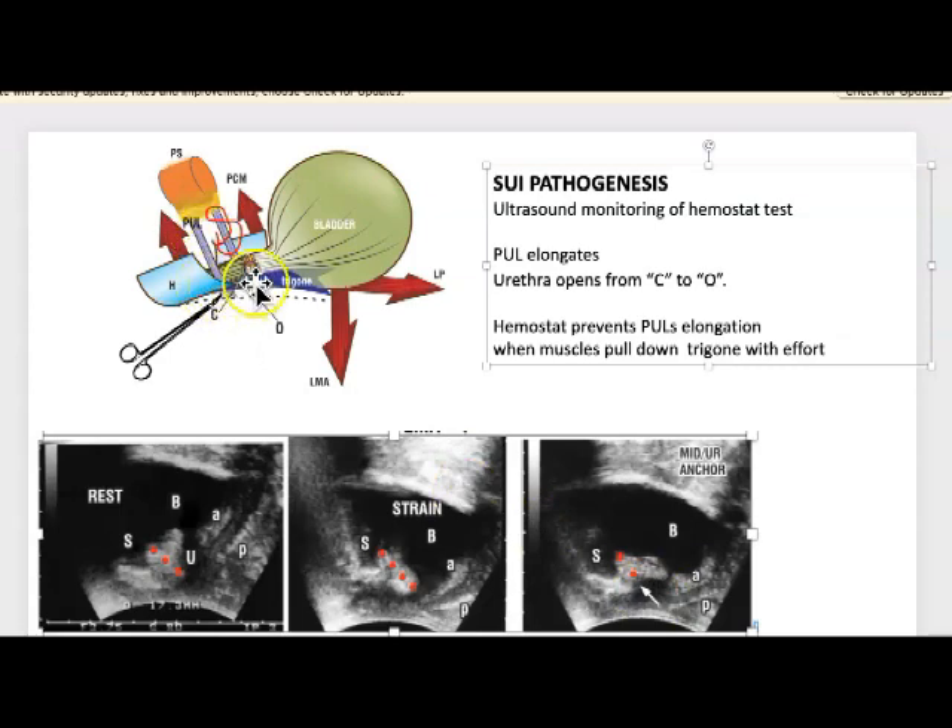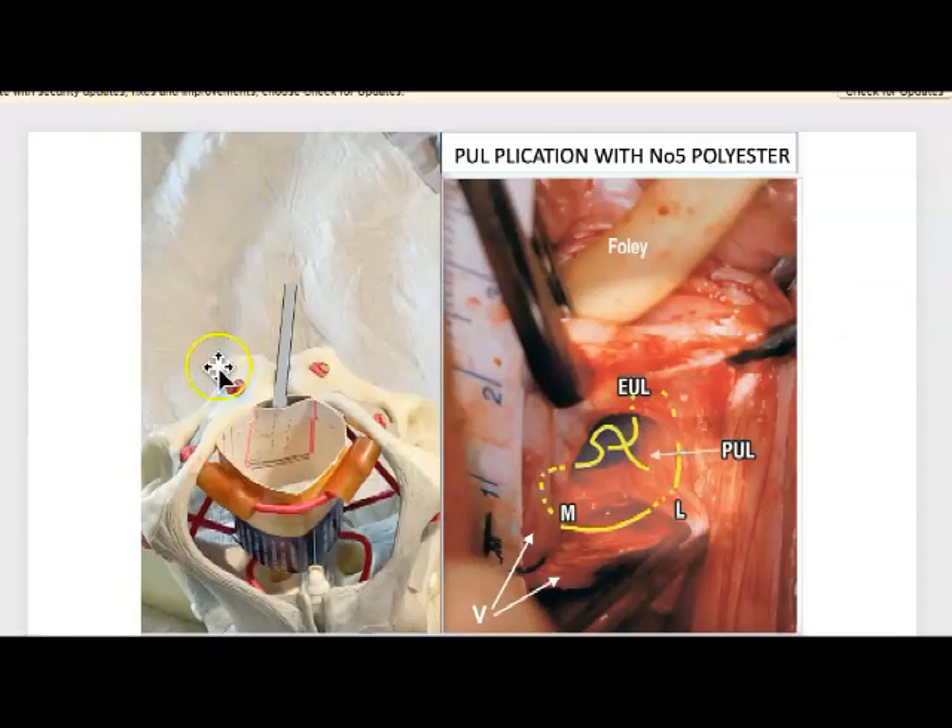The tape stops elongation and stops the opening. The polyester suture will do exactly the same thing — it cinches it and stops it from opening out and elongating. Now I'm going to show you the anatomy of the operation.